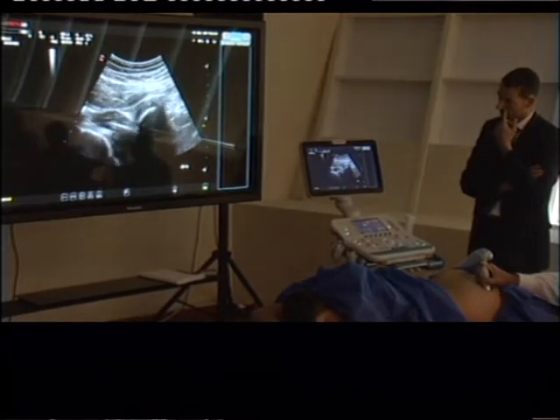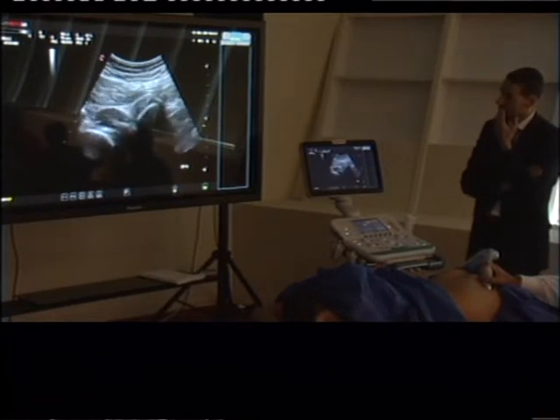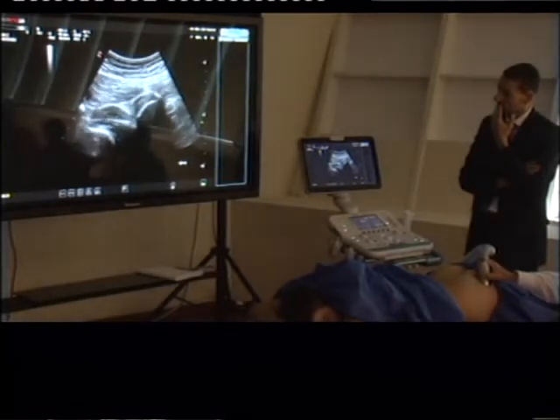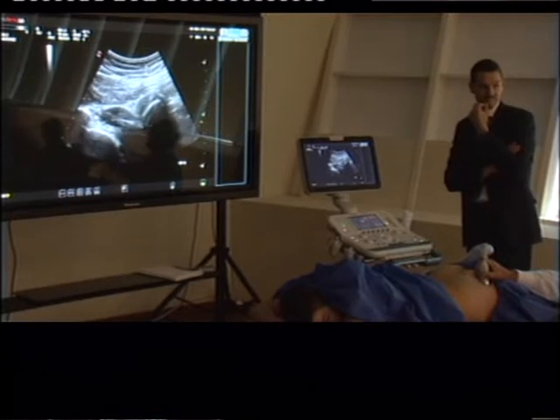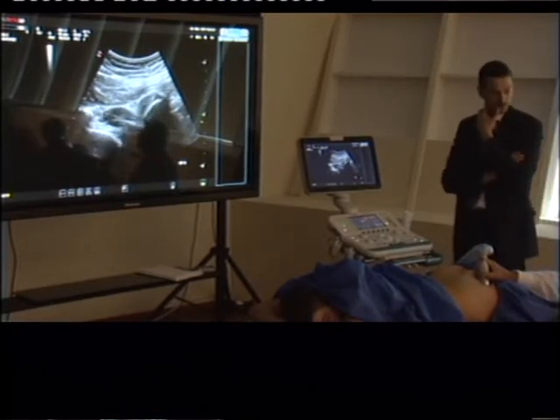Quadratus femoris, sciatic nerve, obturator externus. Conjoint tendon of hamstring, that's the tendon. Now look at the probe, don't look at the screen. Look at the probe, okay? No, sit down, sit down. No, you gotta sit. So I want you to all see how much the probe moves.